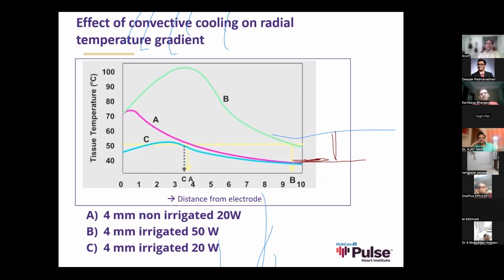The energy we are measuring is the energy going out of the RF generator and coming back to it. That's what we measure in terms of wattage, voltage, impedance and so on. We do not know how much energy is dissipated into the actual tissue right next to the catheter tip. We only know that the energy is dissipated altogether, from the catheter to the grounding patch.